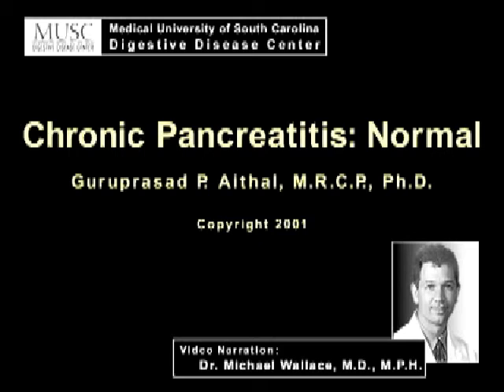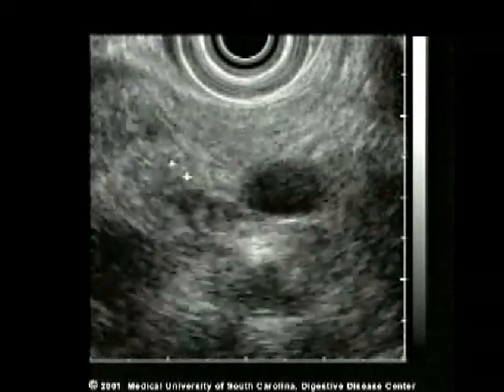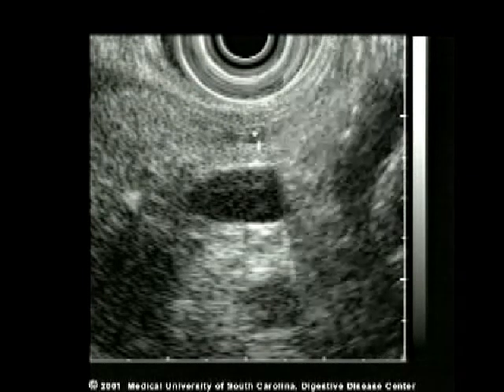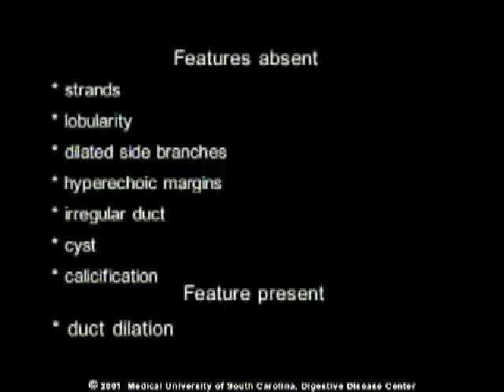This video demonstrates cases from our consensus panel series where the entire group of experts agreed that each examination represented a normal pancreas. Each segment is followed by a description of the features that the entire group agreed were present or absent. Each case was defined by the fact that the entire group agreed that chronic pancreatitis was not present in these examinations.